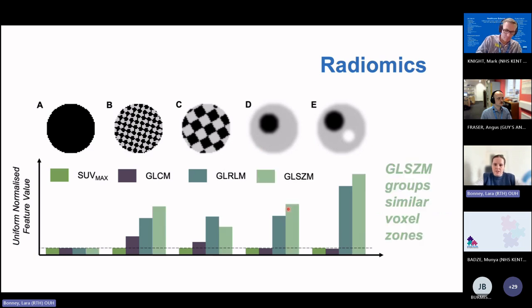And we can start to differentiate between these images quite quickly, actually, across a fairly small number of features. And that's what radiomics is. It's essentially extracting these quantitative measurements from images that can help us differentiate beyond just a single metric. Now, obviously, you'd need as many features as there are voxels in the image if you wanted to do that backwards and perfectly characterize each image. But it's, can we better group and stratify the images to understand how they're behaving?